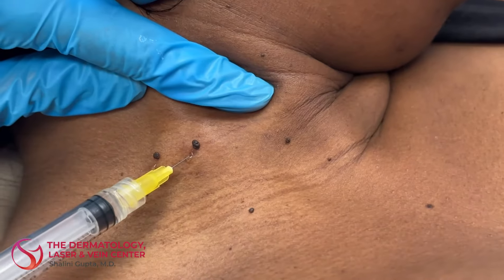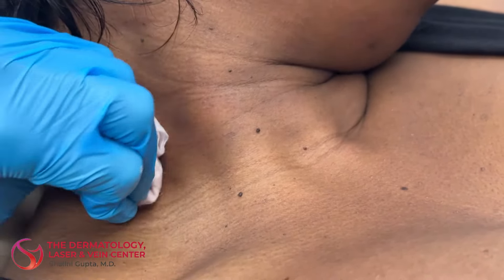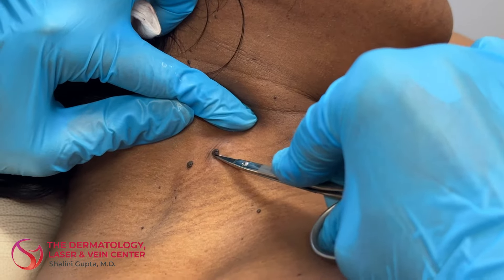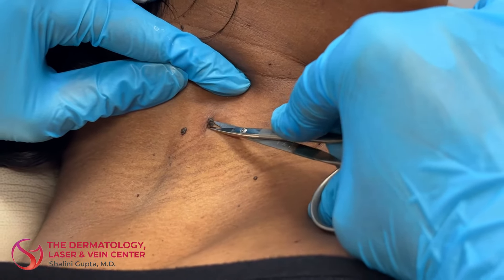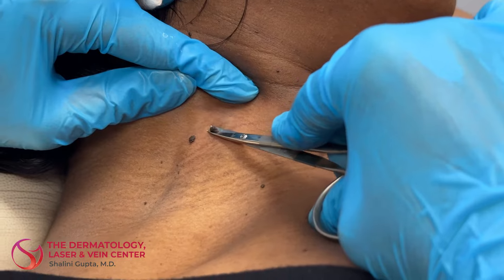We can remove skin tags in a variety of ways. In this case, I'm just going to snip them off, but they can also be lasered — I'll do that if they're smaller, flatter ones. But in this case, because they're so elevated off the skin, it's sometimes easier just to go ahead and clip them off and just be done with them.